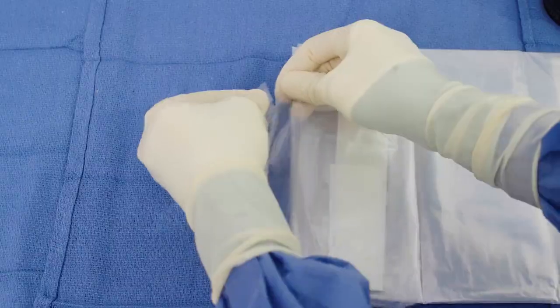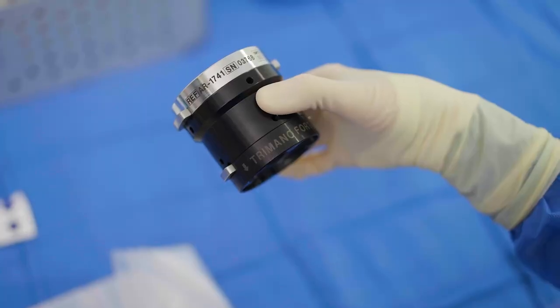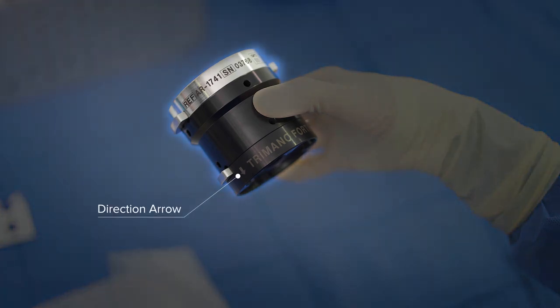Separate the closed side of the sterile sheath at the perforation. When aligning the terminal adapter, note that the direction arrow on the terminal adapter points down.